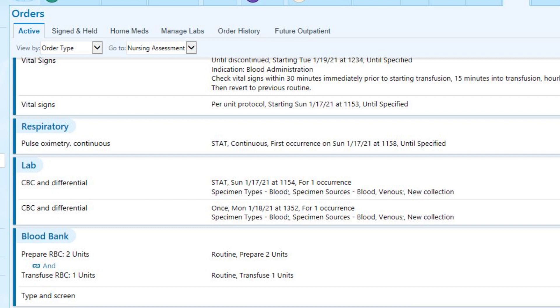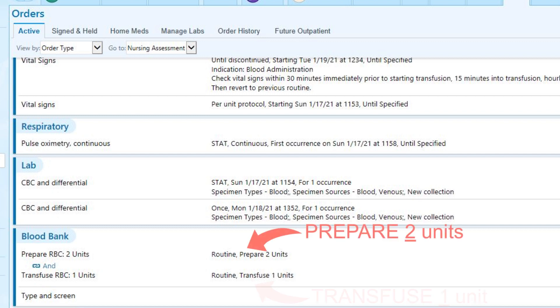Taking a closer look at this particular order, you will notice that two units were ordered to be prepared for this patient, but only one unit is ordered to be transfused right now. That second unit will not be given at this time, but will stay available in blood bank in case further transfusion is necessary.